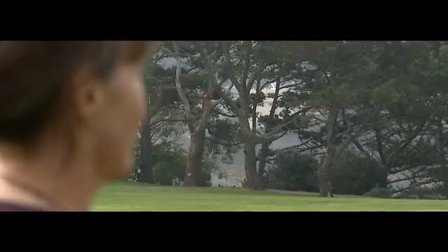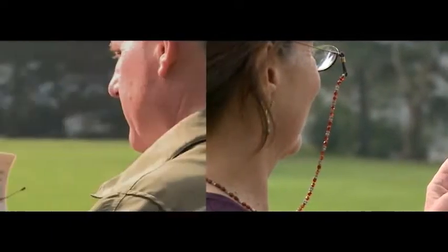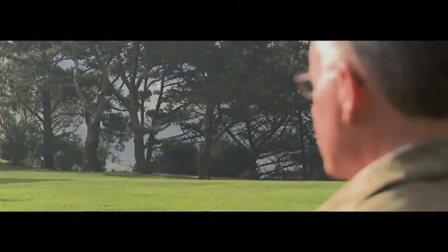However, when you're not wearing glasses, your natural focus will be best at only one of the three ranges: far, intermediate, or near. You and your doctor will decide what distance is best for you. With a monofocal IOL set for distance, you will need to wear reading glasses for close-up vision. If you choose to have a monofocal IOL set for near vision, allowing you to read without eyeglasses, then you will need glasses to see clearly in the distance.